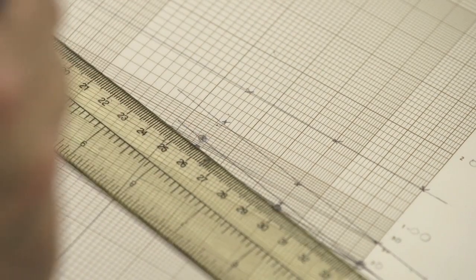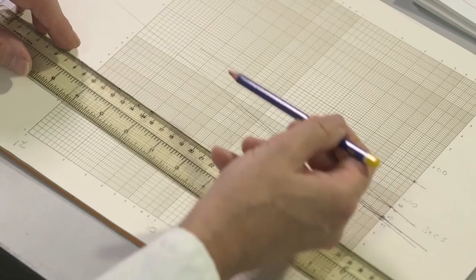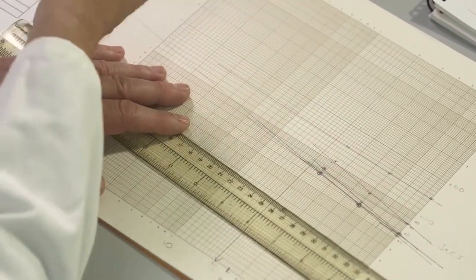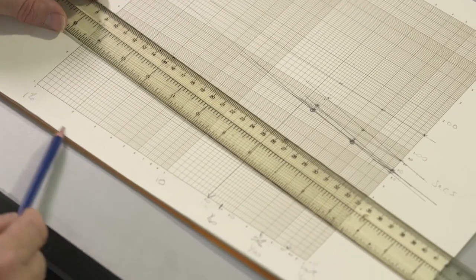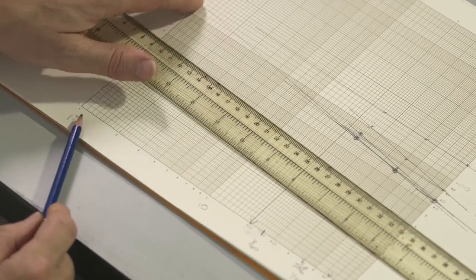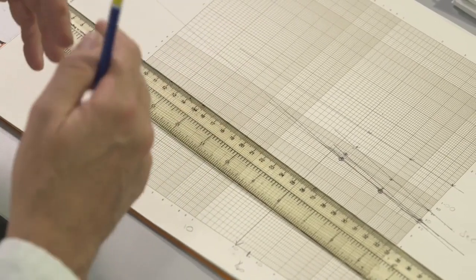But if we look again at the calibration curve, if this were extrapolated, and in particular if we had those additional dilutions to confirm the linearity, sometimes it's not present, but it may be, then we can see that the clotting time here would disappear off scale in this opposite direction. And remember, 100%, 10%, 1%. It will intersect the axis substantially below the 1% point. So from putting all that information together, the level of factor VIII in this sample, less than 1 international unit per deciliter.